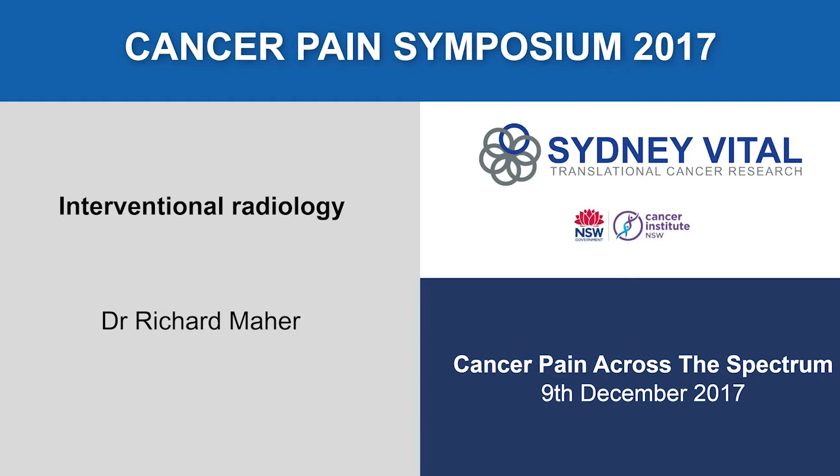So this is a zoomed up image of a patient with a pancreatic cancer, a low density pancreatic mass. I'm showing this because this is the aorta, the right and left crus of the diaphragm, adrenal gland, IVC, portal vein, gastroduodenal artery, and duodenum. And then we get into small bowel. Thank you, that looks better.